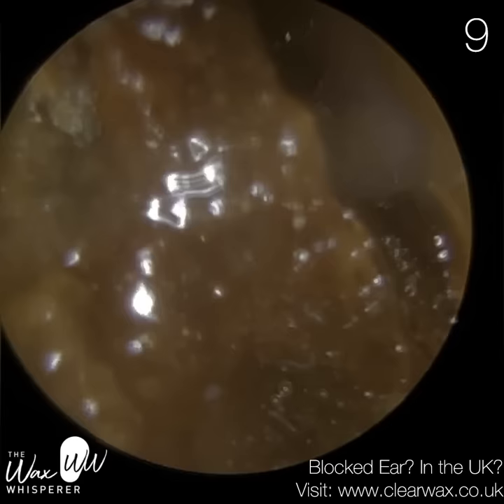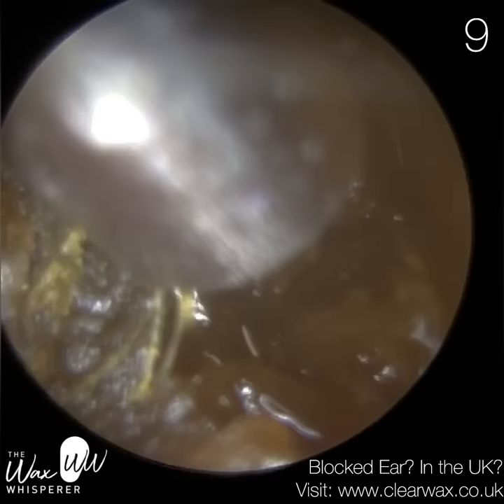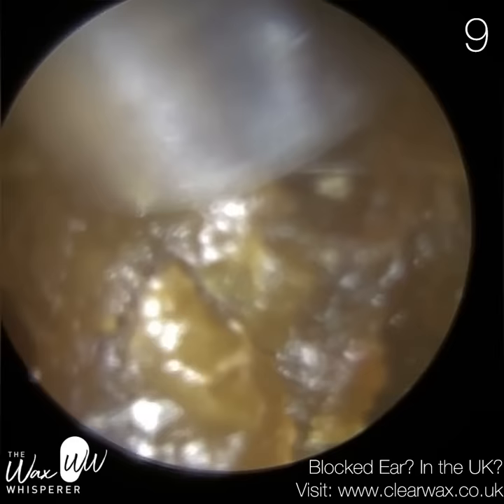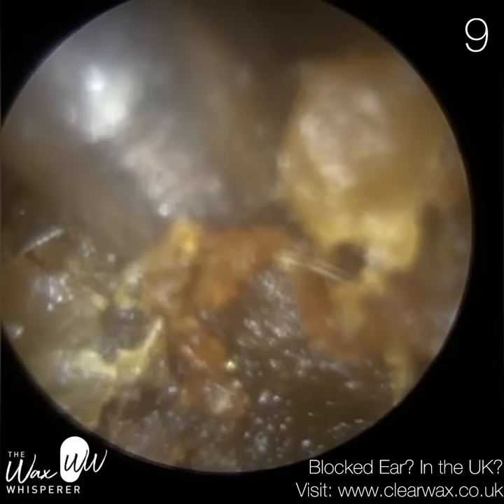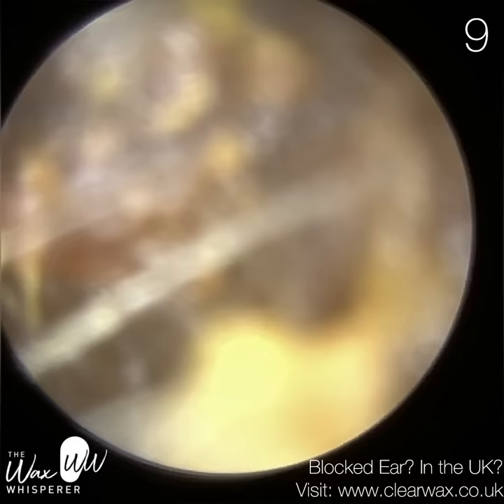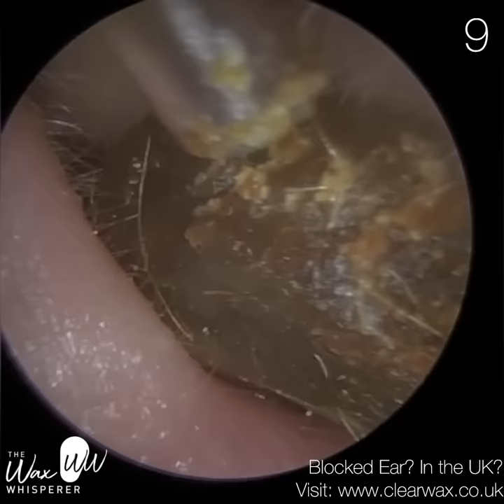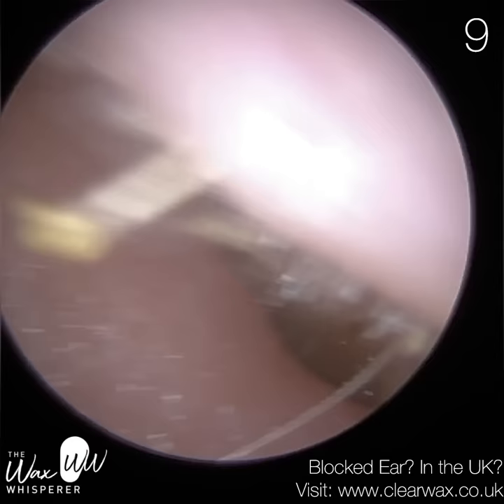Patient nine has this kind of mud, sticky type of wax. I've put some olive oil spray in there to change the consistency — to help bind it together but also to reduce blockages. When you've got wax like this and you're performing microsuction, sometimes the wax can travel up the tube and block it, causing you to lose suction power. That means coming out of the ear, halting the procedure, using a cleaning rod to unblock the suction probe, and then re-entering. On this occasion it worked really well and that plug came out in a singular piece.